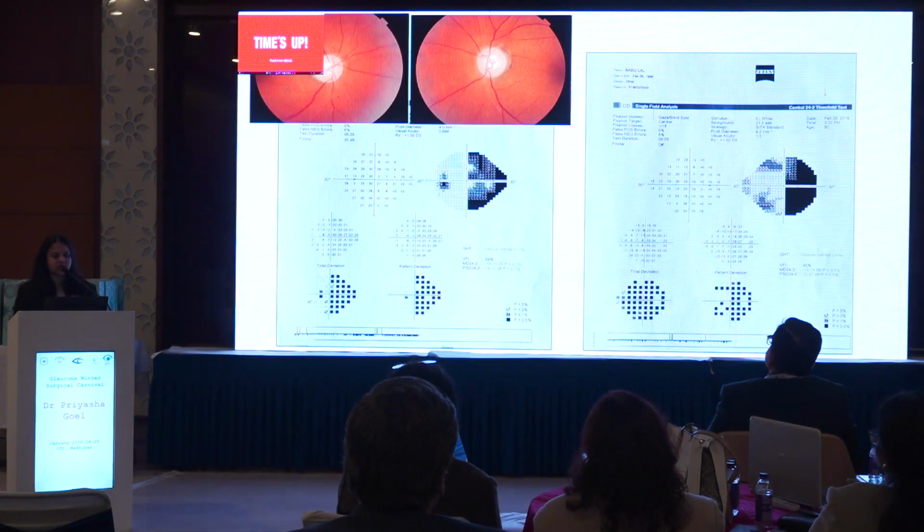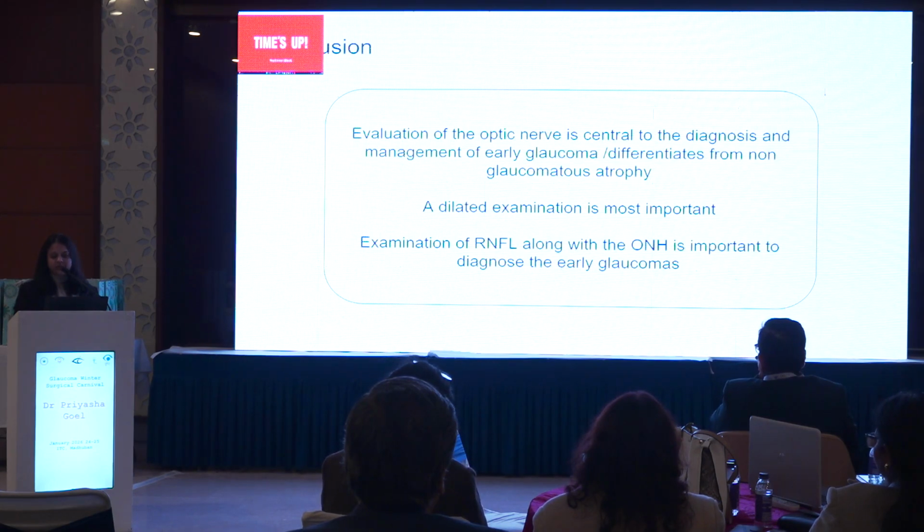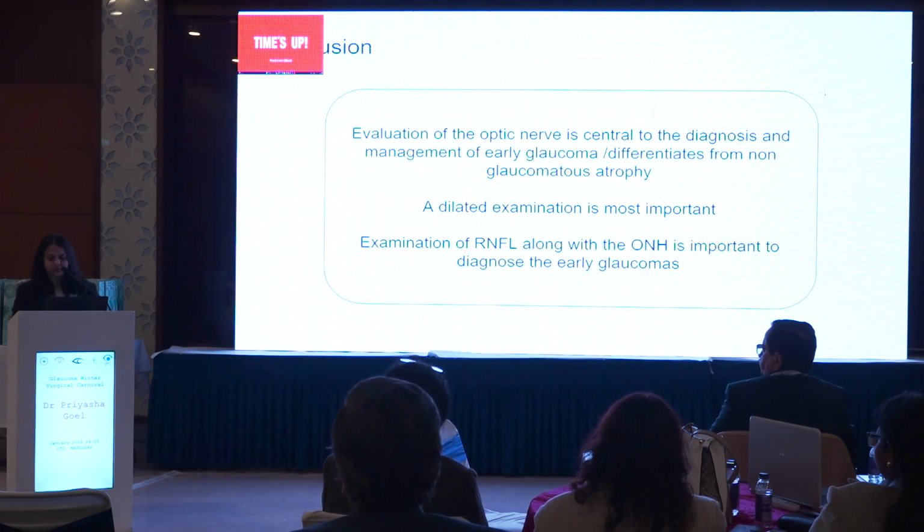To conclude, evaluation of the optic nerve is central to diagnosis and management of early glaucoma, and it differentiates it from non-glaucomatous atrophy. Dilated examination is the most important, and examination of the RNFL along with the ONH is important for early diagnosis of glaucoma.